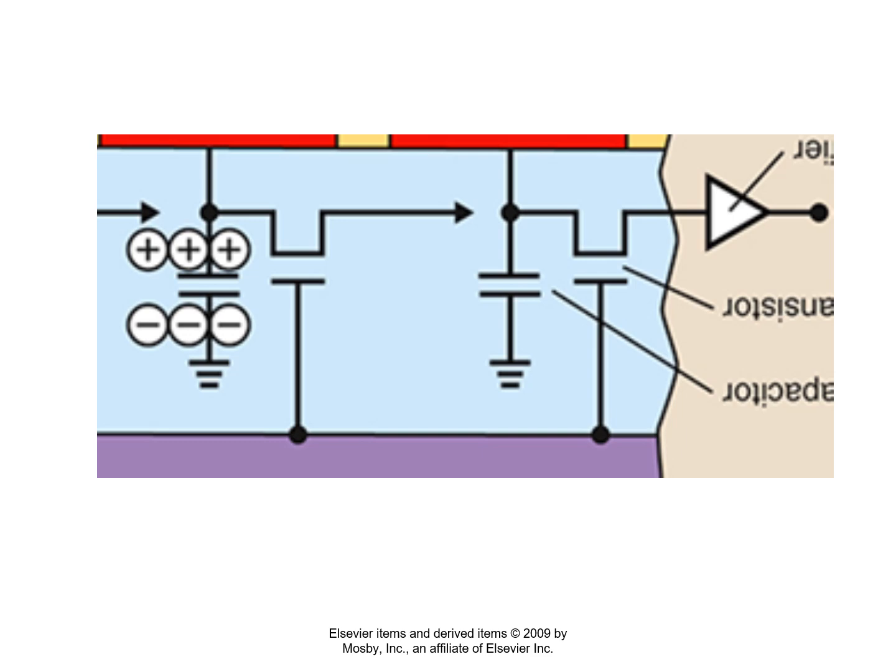The ground supplies a balance of charges to hold on to the positive charges that have migrated over, okay, until we're ready for readout. When we're ready for readout, we supply a gate voltage to the transistor, which is to the immediate right of the storage capacitor. It's more negative charges than what the ground is supplying, and so it's a stronger Coulomb force, and so the stored positive charges move through the gate and end up in the amplifier.